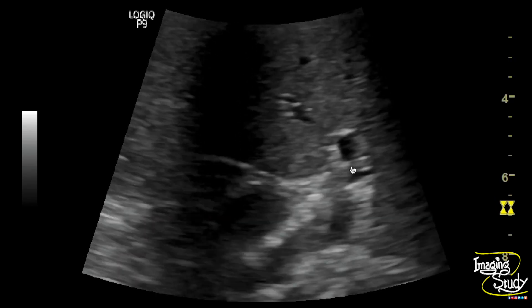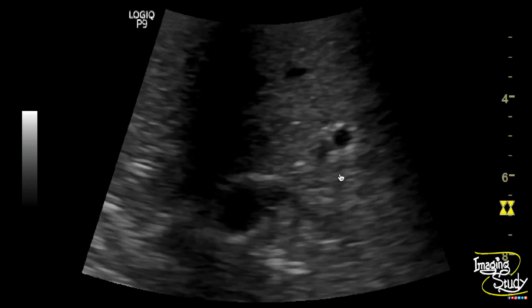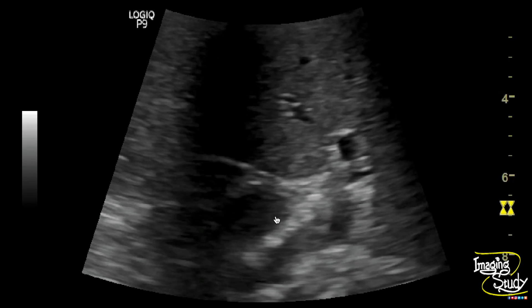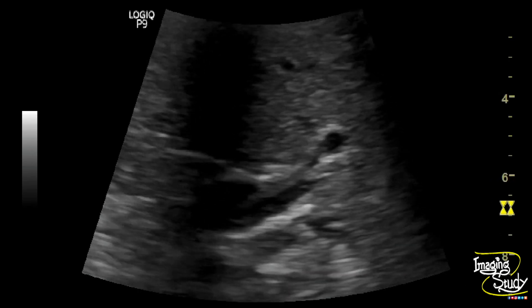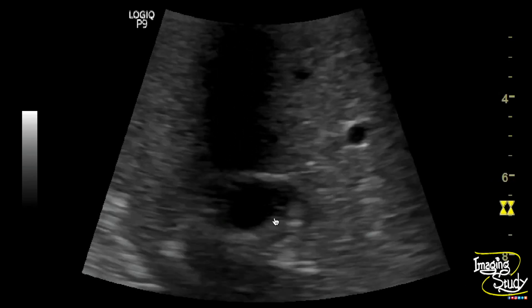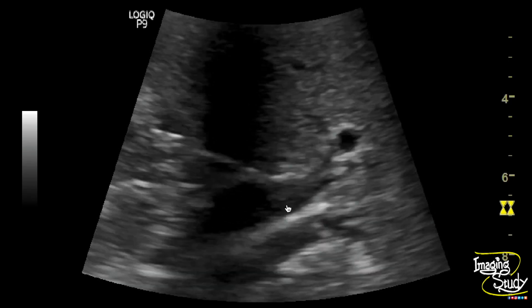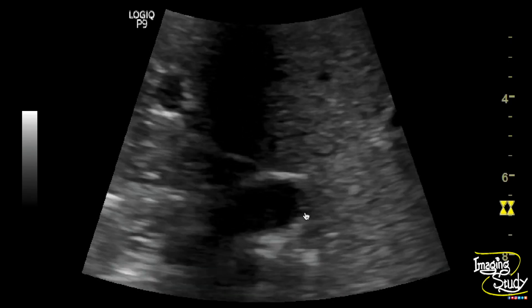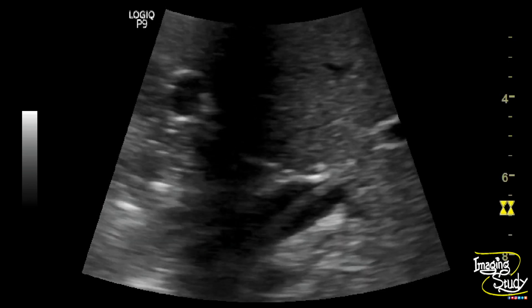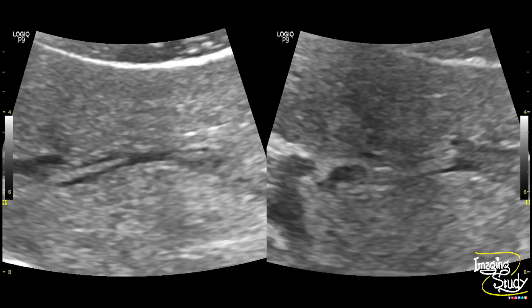So this is a case of biliary ascaris, and this structure is a live worm within the left hepatic duct. Here's the picture of the linear tubular structure within the dilated left hepatic duct indicating Ascaris lumbricoides.